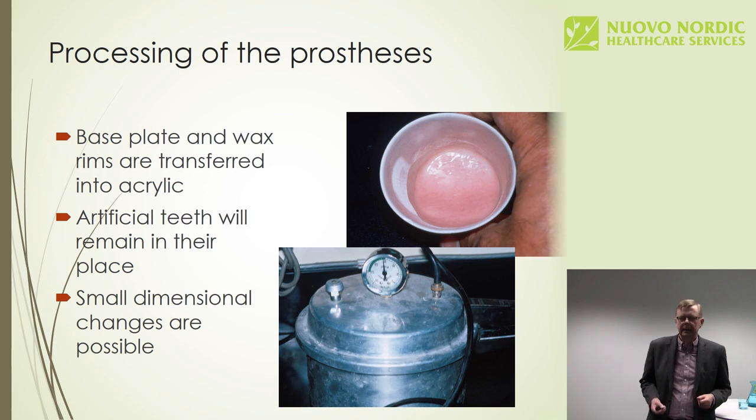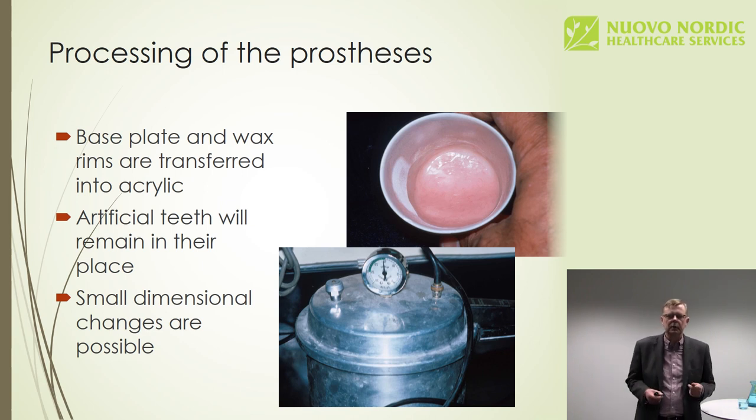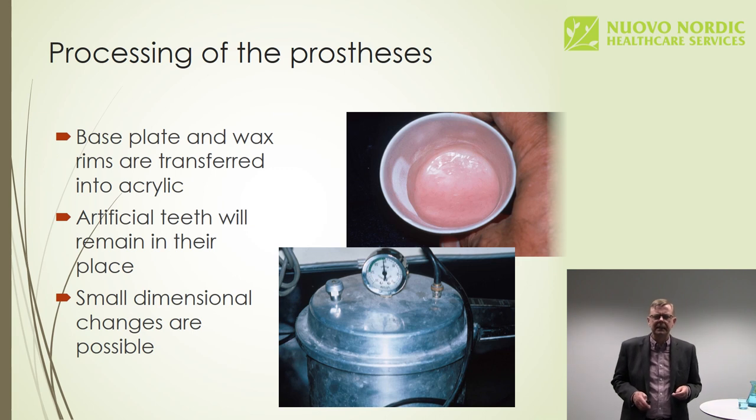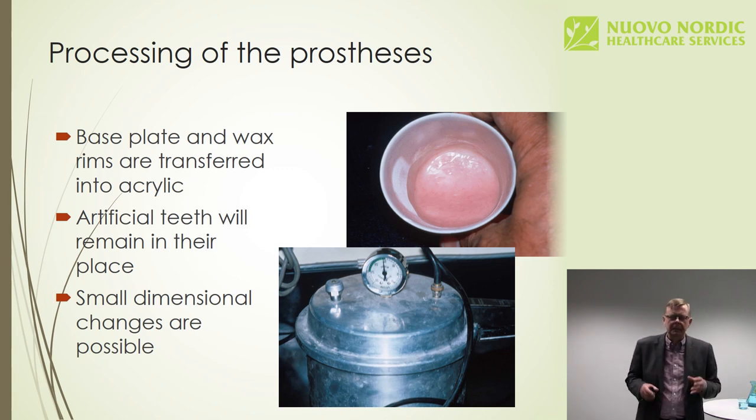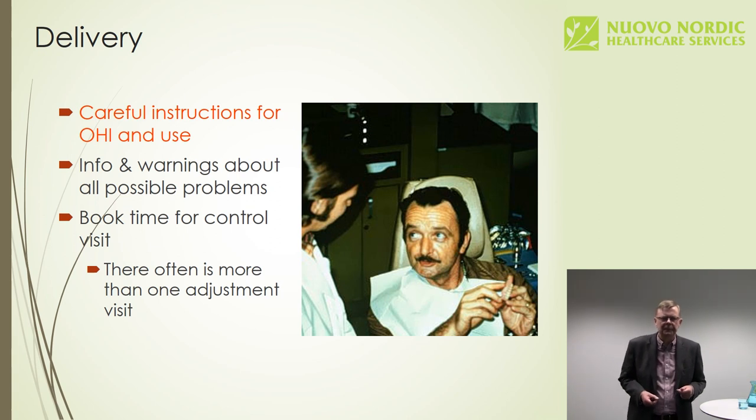Whether it's injectable acrylic or whatever, it's up to you. Anyway, the processing will perhaps make some small or minor dimensional changes, especially in the position of the teeth. However, they shouldn't become a problem.